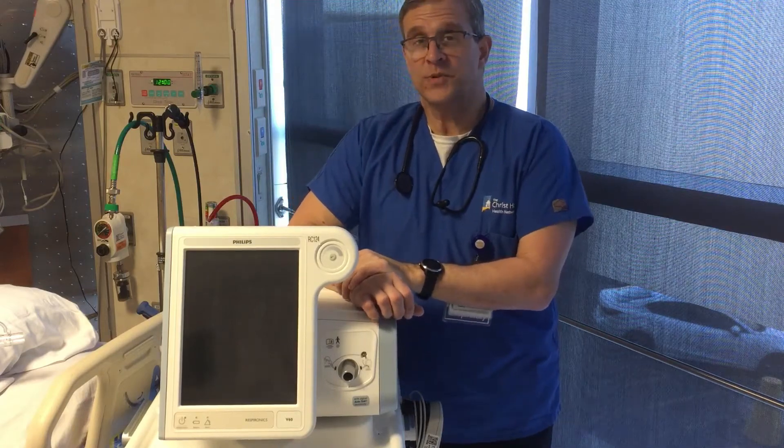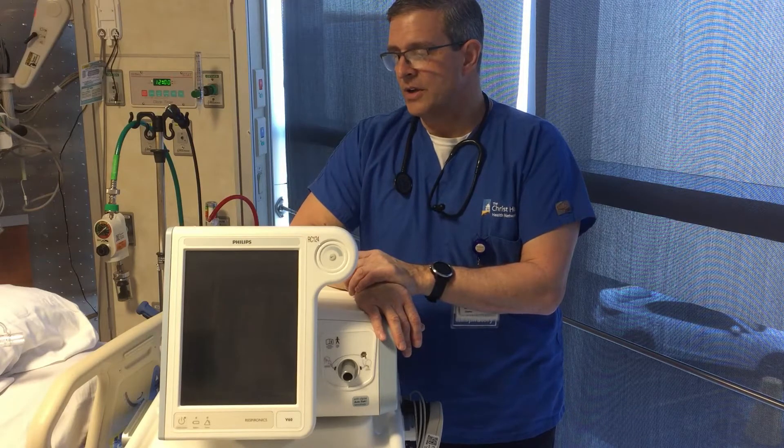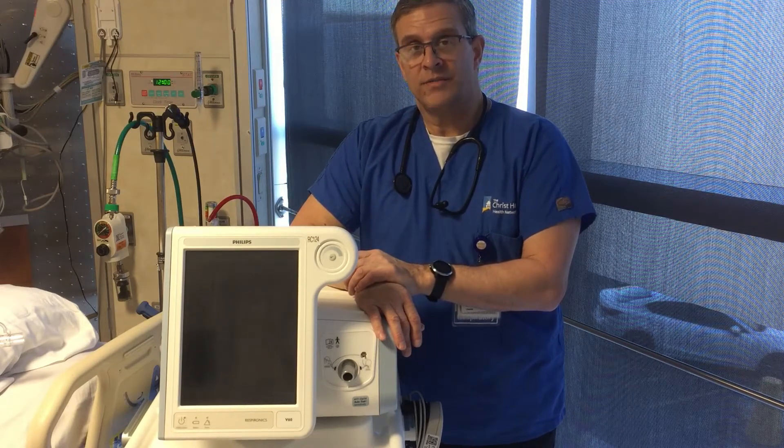Hi, my name is Mike. I'm a respiratory therapist. I'm in the ICU here with you today and going to talk about the setup of non-invasive ventilation.